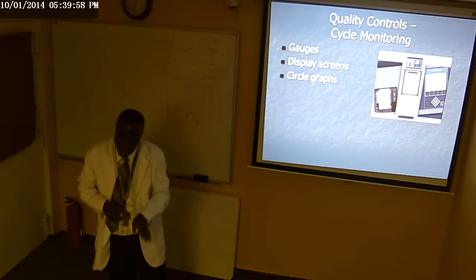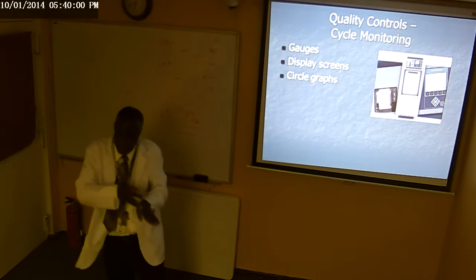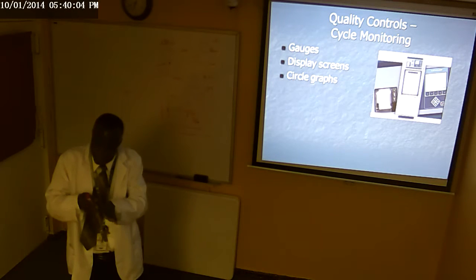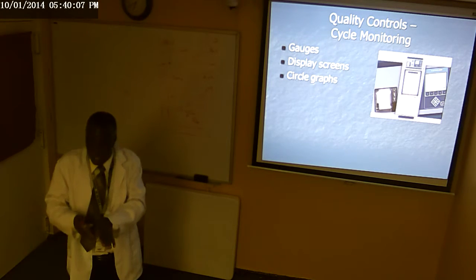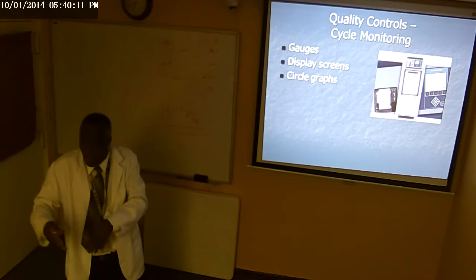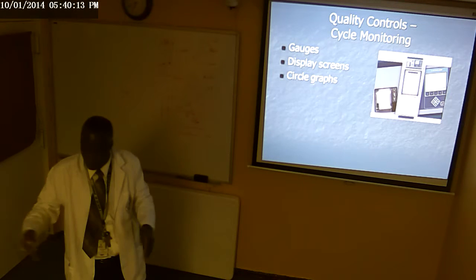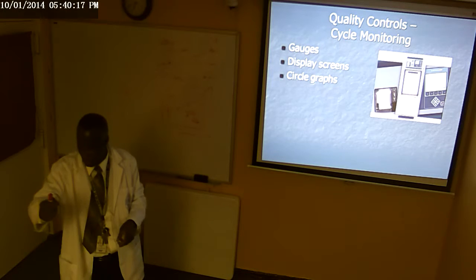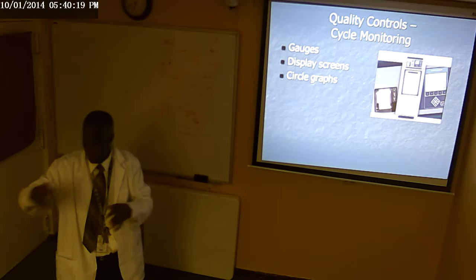After sterilization at 10 o'clock, you give me 3 minutes. So it is going. At 10:03, it stops. And then you're going to do evacuation, 2 minutes. Then it goes to dry mode, and that is recorded too. Then it's going to tell you this is the highest temperature, this is the lowest temperature, exposure time was 3 minutes. The whole process took me what? 45 minutes.